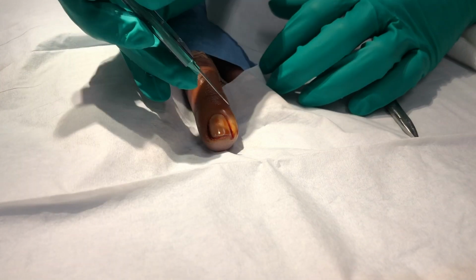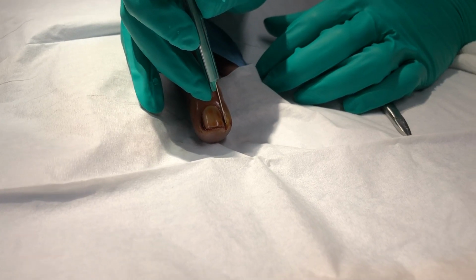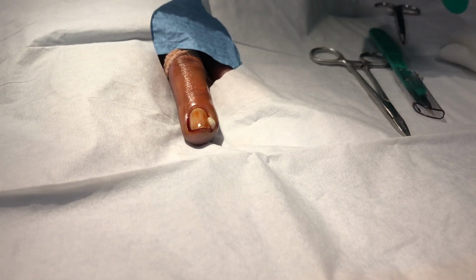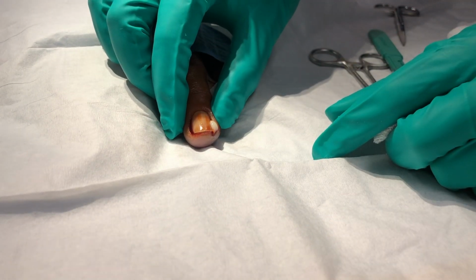The area of fluctuance is incised with the scalpel in the longitudinal plane that is parallel to the lateral nail edge. You can see purulence is expressed as the incision is made. At this time, a wound culture could be obtained if desired. And then further expression of purulent material is performed with manual pressure in the surrounding area.